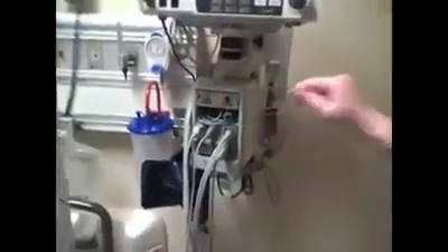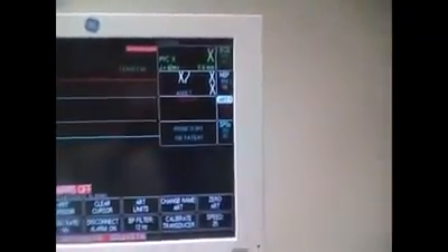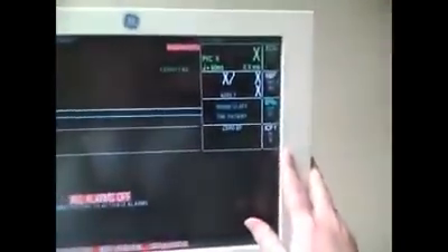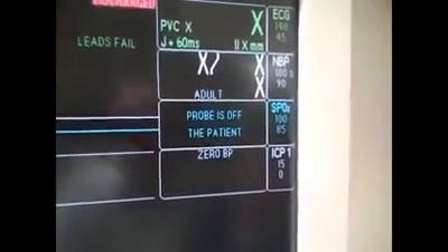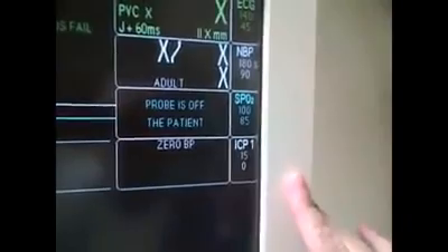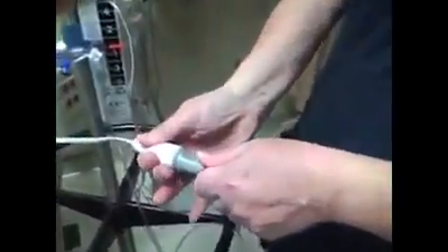When you plug it into the monitor, ours usually come up automatically to arterial, so you need to change it. Use your toggle knob to highlight ART, push your knob in, and it gives you options — select 'change the name' and pick ICP. You'll see it now measures for ICP. For an arterial line the color code is red; for ICP the color changes to white, so if you're looking for a red box you won't find it — ICP defaults to white. Now take your cable and your transducer and attach them together.